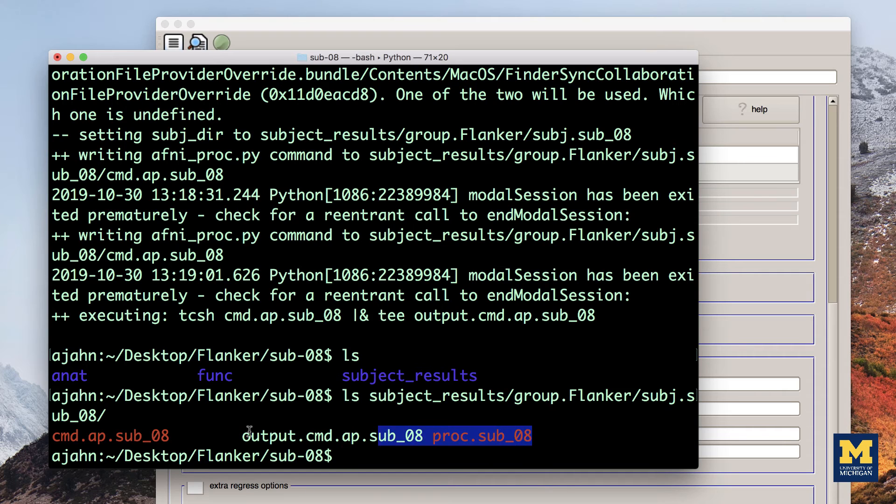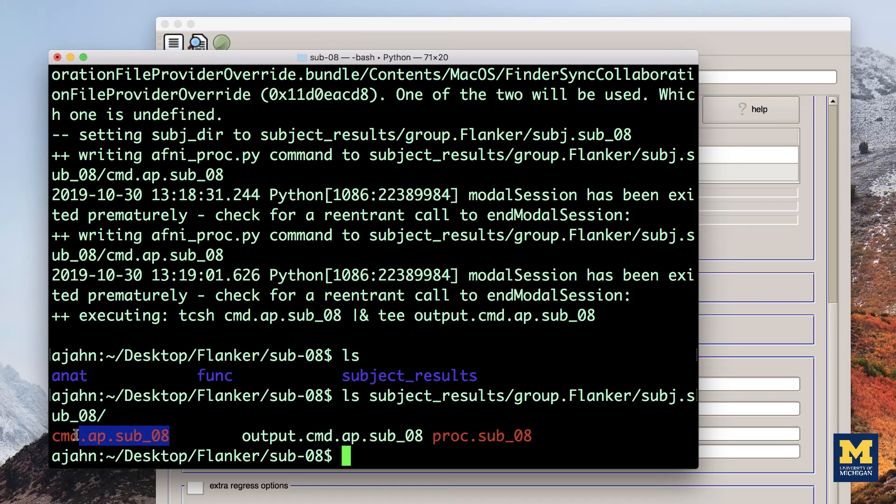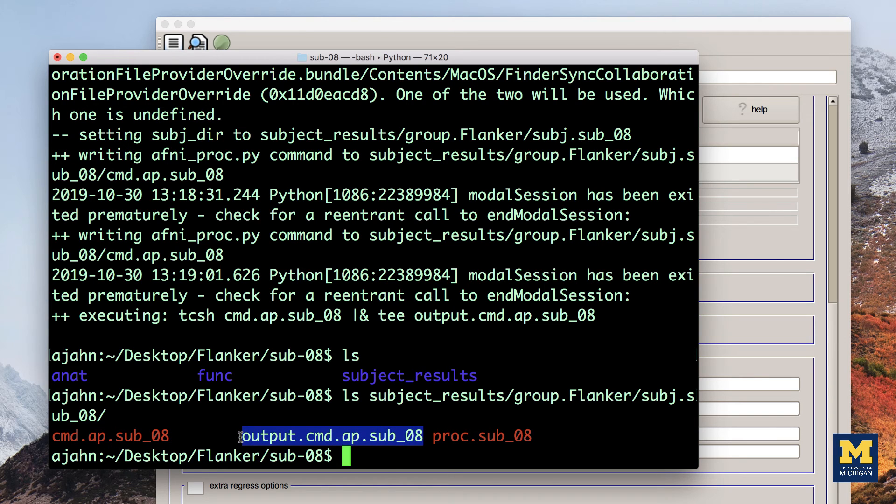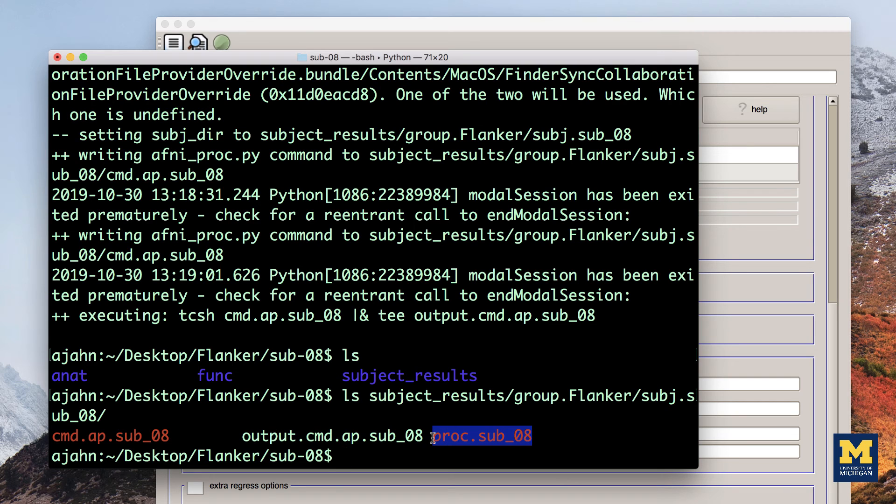cmd dot ap dot sub 08 is the AFNI PROC PY file that was generated by Ubersubject dot PY. Output dot cmd dot ap dot sub 08 is the output of AFNI PROC PY that generates any warnings or errors that you should be aware of. Proc dot sub 08 is the raw AFNI commands that will perform the actual pre-processing, as compiled by the AFNI PROC dot PY command.